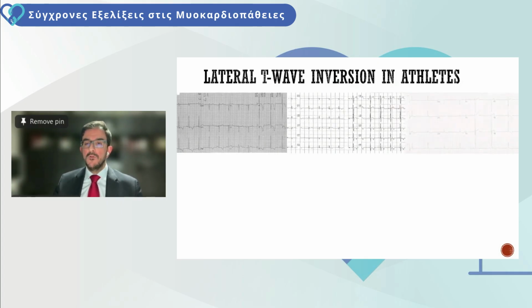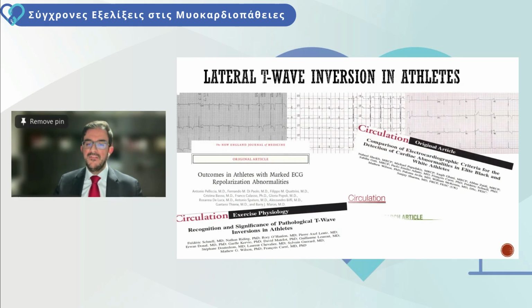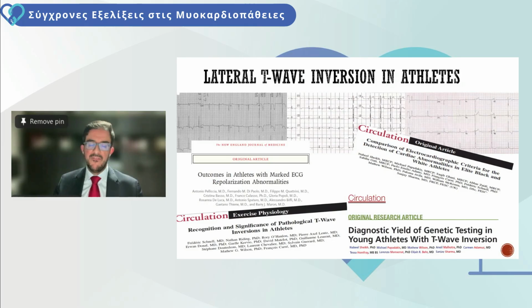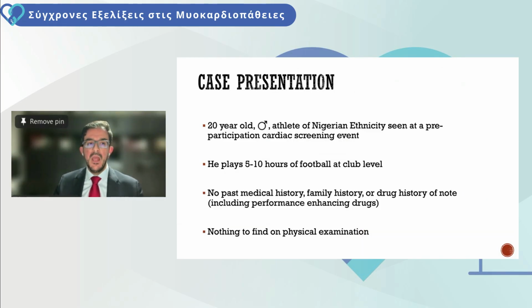And we've got data not only from our study, but from other studies as well, from Antonio Pelliccia, from Frédéric Schnell in France, that clearly highlight the diagnostic yield of investigating lateral T-wave inversions. And as I said, that's why I would strongly encourage you to investigate athletic individuals with such ECG anomalies fairly comprehensively. Now, let me show you a case of a 20-year-old football player.